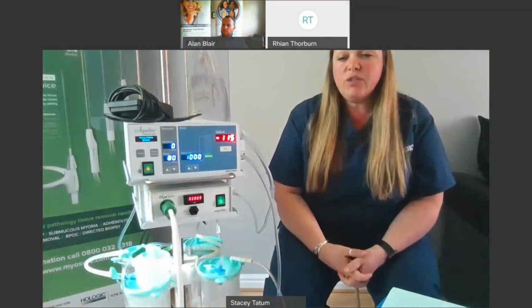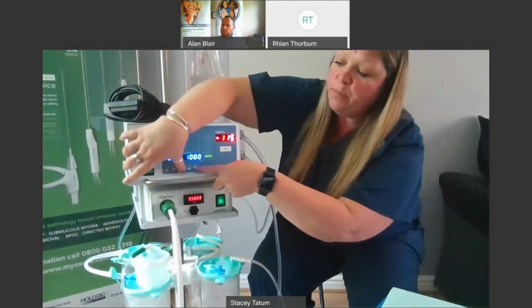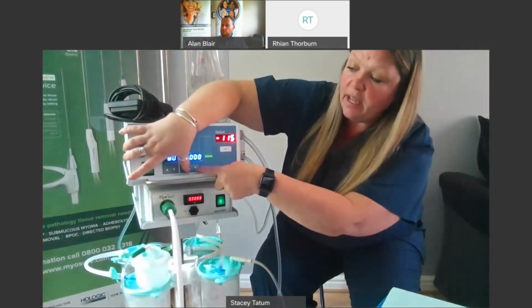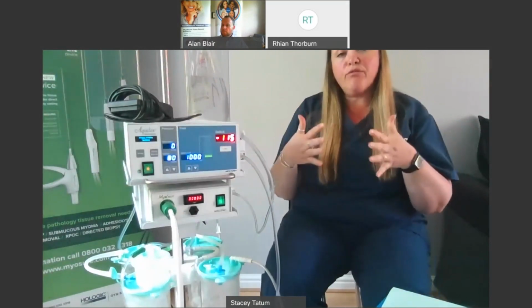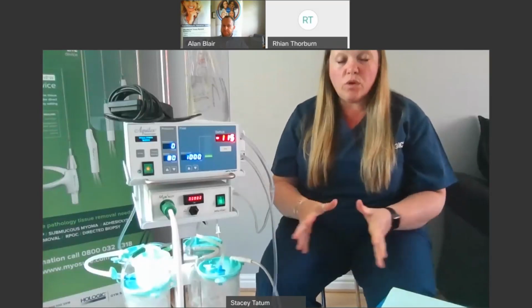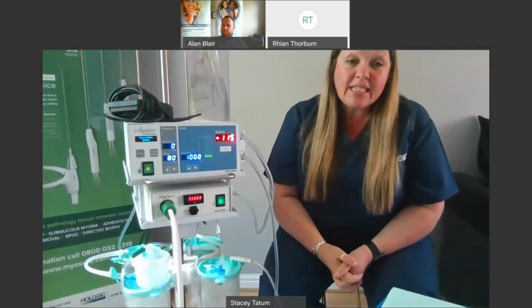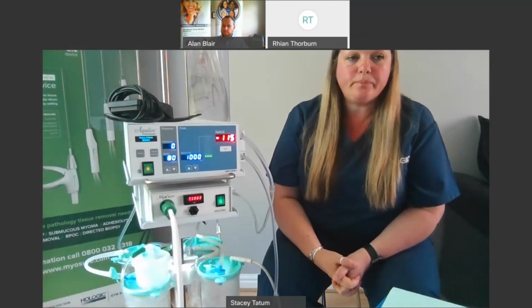If that is the case, what you can do is use the two-finger technique. If you press both of these arrows at the same time, the fluid deficit and fluid limit arrows, it will give you the exact amount that's been through your patient. You would then know what's been in, and you can calculate with your canisters and what's on the floor, whether you want to mop it up and weigh it, or whether you're going to estimate it. You can estimate, or you can calculate your fluid deficit.